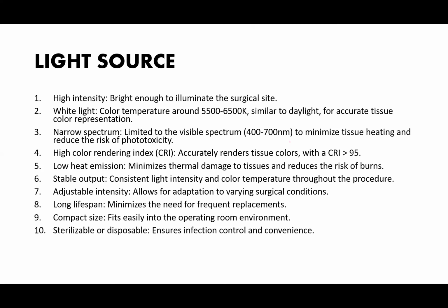Okay. Now, white light, color temperature around 5500 to 6500 K, similar to daylight, for accurate tissue color representation.